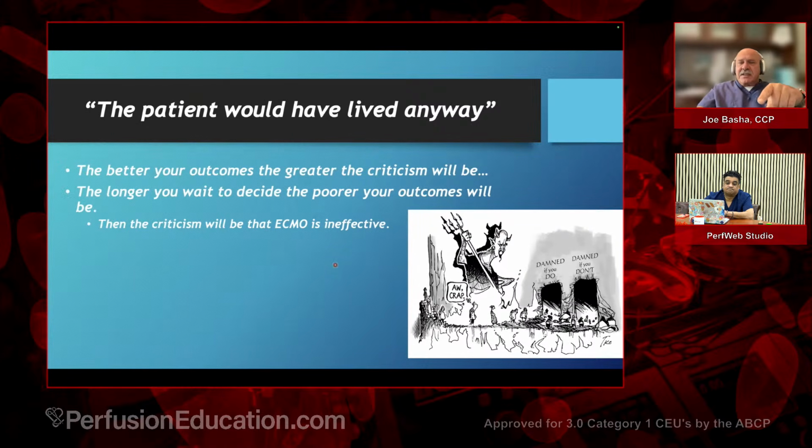So this is very interesting, and I want to bring this slide up because one of the things I'm going to talk about very quickly is I've heard people say, because I've seen ECMO done well and I've seen ECMO done not so well. I've seen patients put on ECMO early. I've seen patients put on ECMO where it made perfectly good sense to do it. I've seen patients put on ECMO when I don't know why we're putting this patient on ECMO. This seems completely unsalvageable, not a salvageable situation.